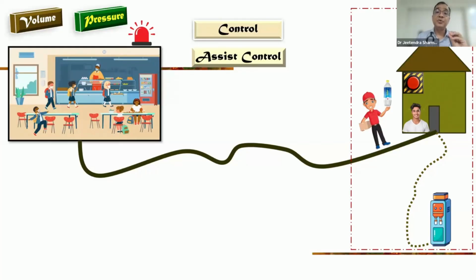Understood? Suppose at 6 a.m. the fixed bottle has come. Instead of 2 p.m., I triggered at 1 p.m. Then the bottle which was expected at 2 p.m. will be delivered. Now what will happen at 2 p.m.? Nothing will happen. Nothing. The next bottle will come at 10 p.m. only. So what is the difference from the earlier arrangement?